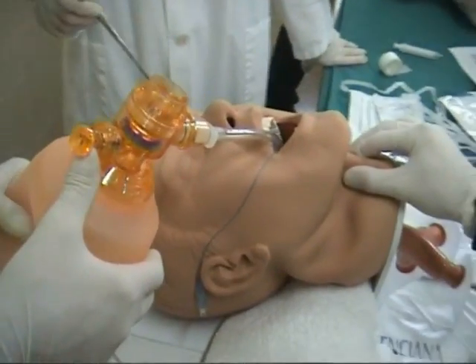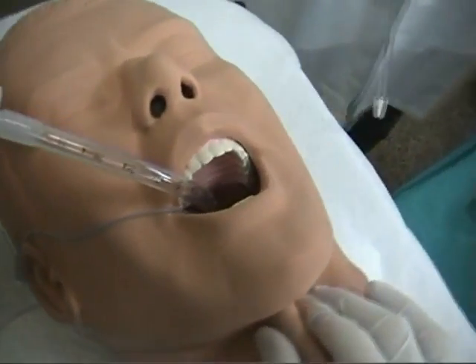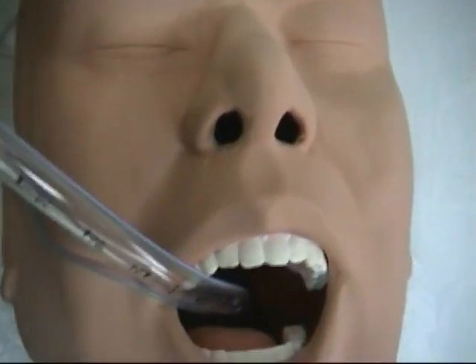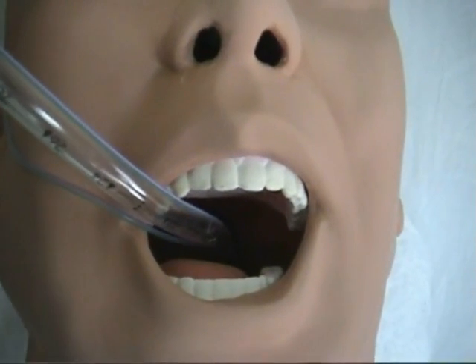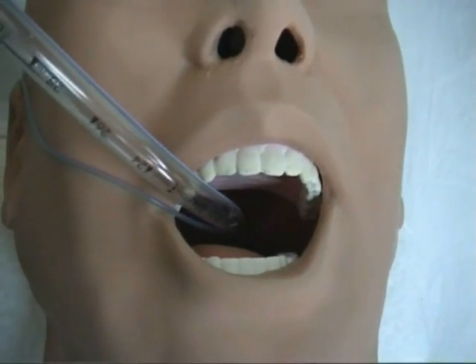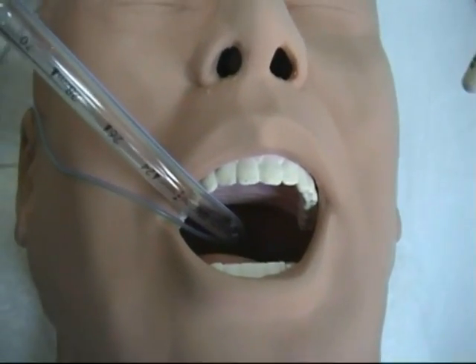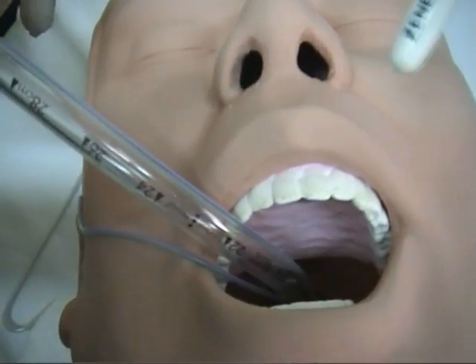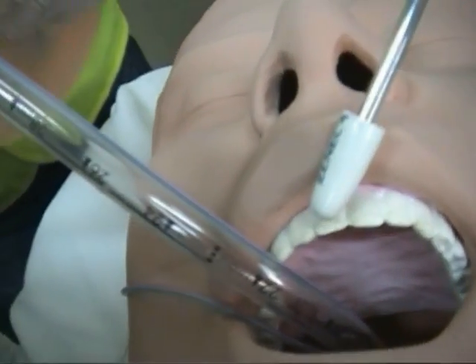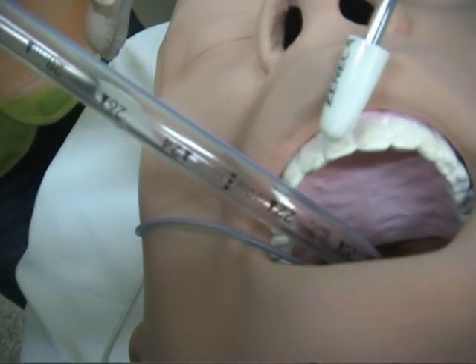The following step is to confirm the position of the endotracheal tube. The position of the endotracheal tube should be assessed by auscultation. The end of the endotracheal tube should lie in the mid-trachea 3 to 7 centimeters above the carina. A good rule could be 22 centimeters at the teeth for the average size adult.